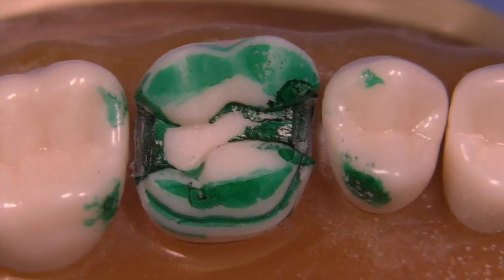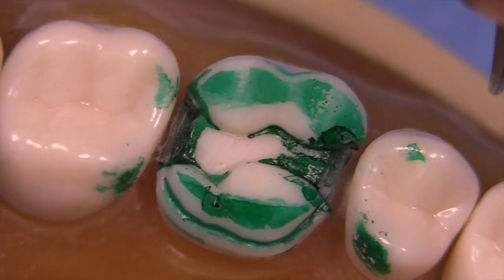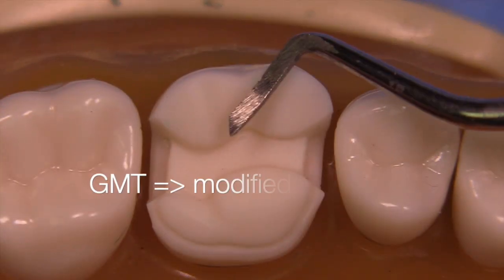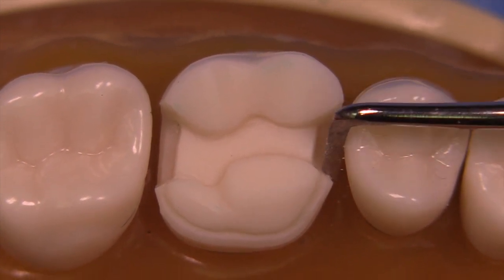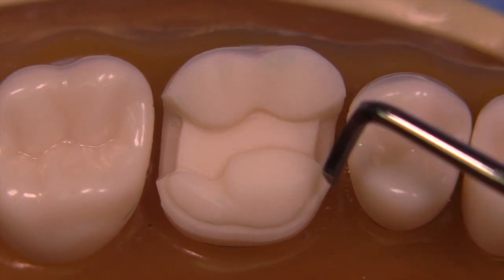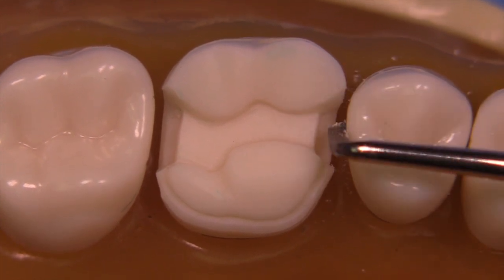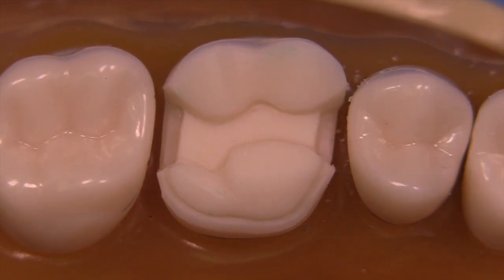The burr is not able to get into the line angles on the facial and lingual sides at the gingival, so to complete the bevel you'll need a gingival margin trimmer modified to 60 degrees. Start in the middle and move towards the lingual, then flip the instrument and push towards the facial. You can see that little piece of tooth structure that just snapped off — that was an area the burr couldn't reach without creating an undercut.